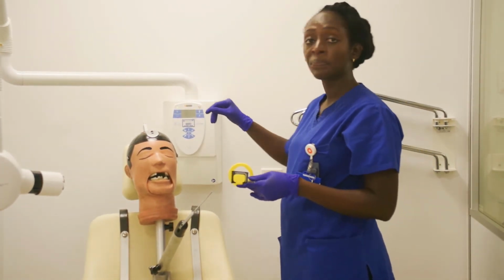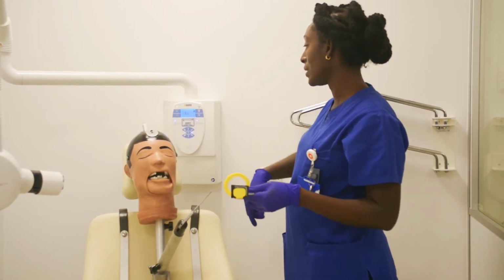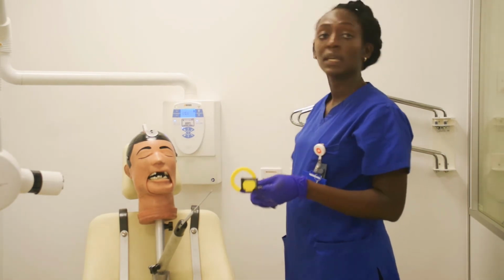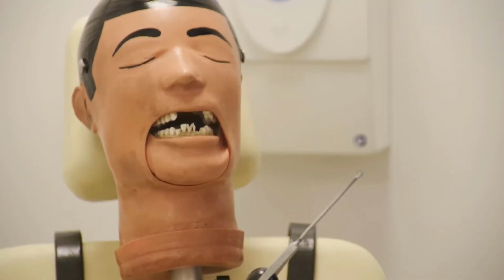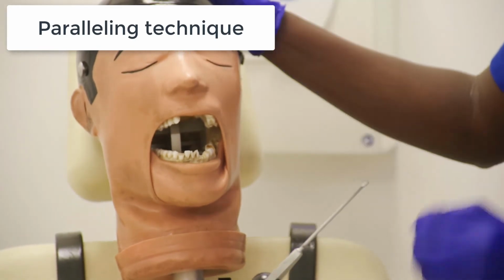So for the upper left 6, I'm going to set the parameters. I've got Dexter as an adult, so I've set this for an adult. Upper left 6, premolar, molar, sorry. So I've got it there, and it's on 70 kV, so I'm ready to go. Okay, good. So at this point, I'm going to get Dexter to open the mouth really wide, and that's what you want to get the patient to do.